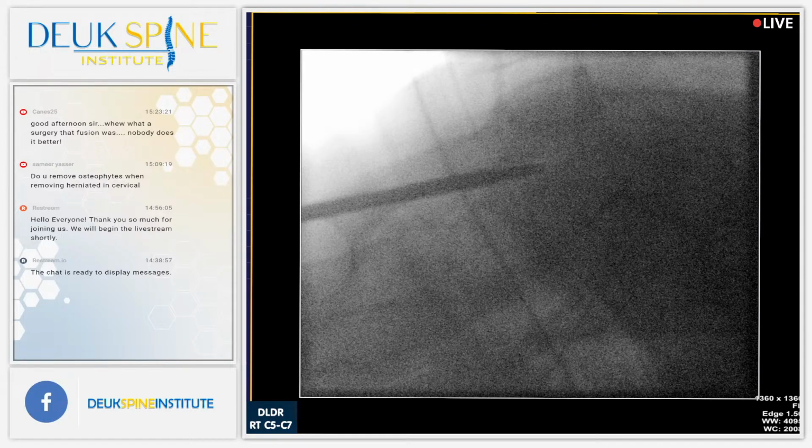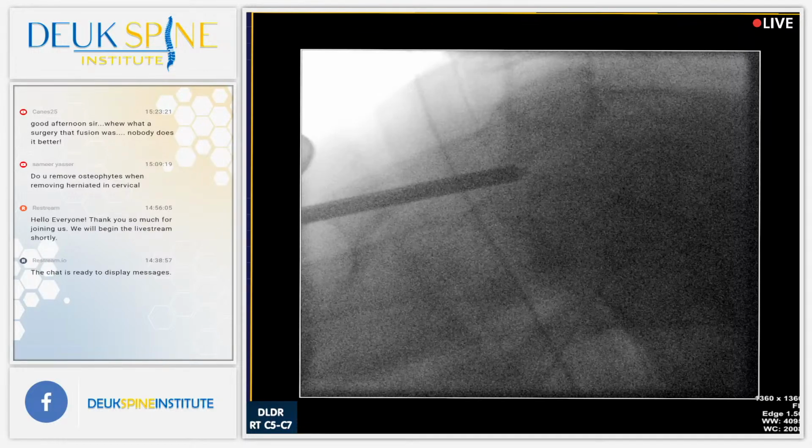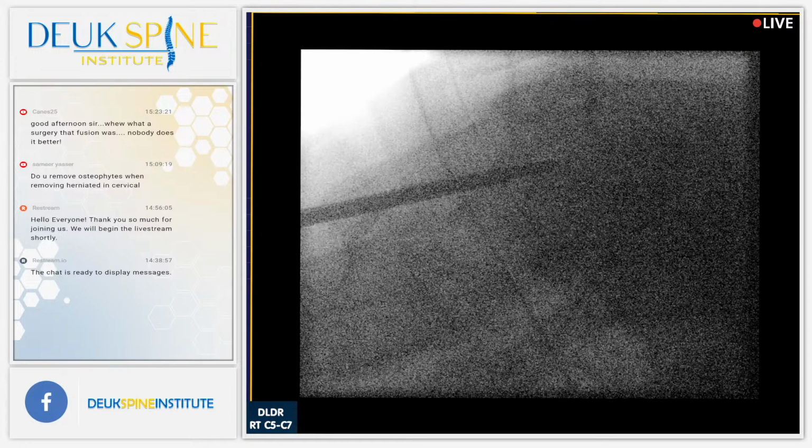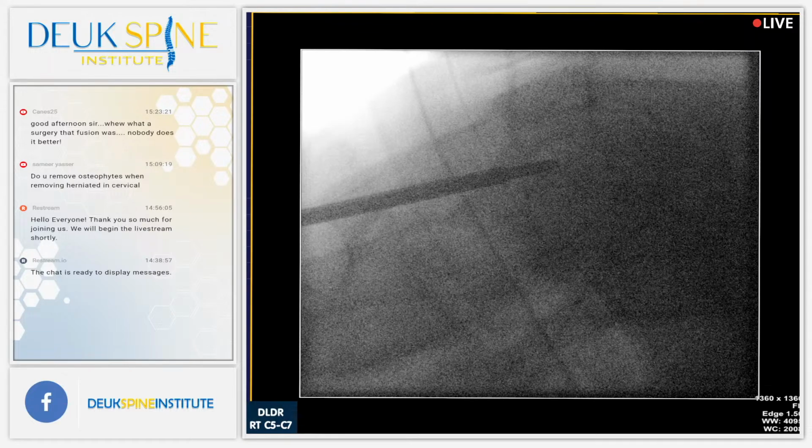That's better. That's putting the tube in. I need to get the dilator in. No, take that off. Shot. See, I'm having the same thing with that bone right inside the disc. Shot. He's got the same problem here. Shot.